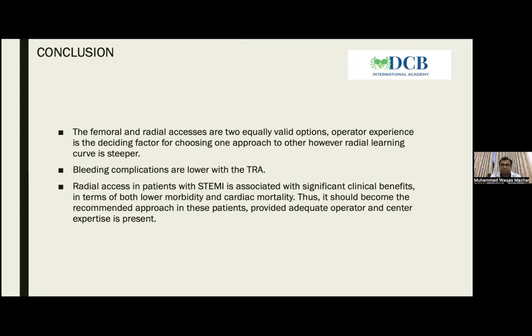We have seen from the TAVI spread ten years ago or a little bit more that the first cause for mortality after TAVI was the approach, because we learned with these valves how to perfectly implant them, and patients didn't die in the vast majority of the cases from the TAVI implantation, but from the approach, because we were not prepared to face and to treat the complications with a femoral approach. And then this changed the scenario and the approach to the approach.